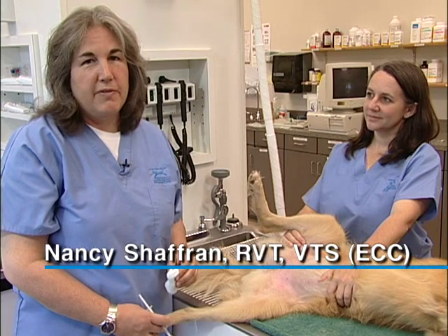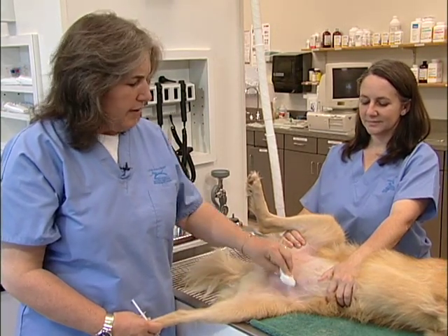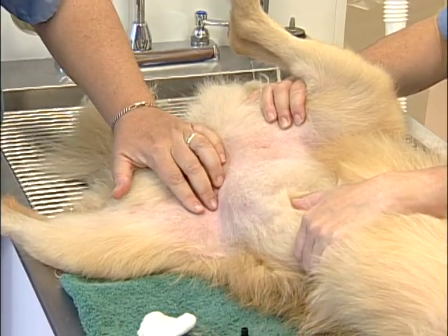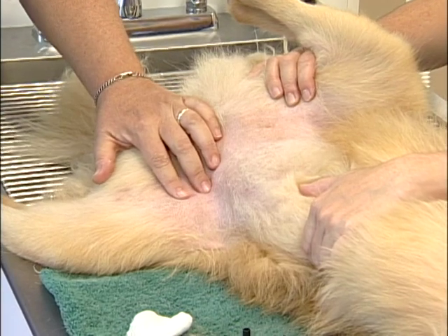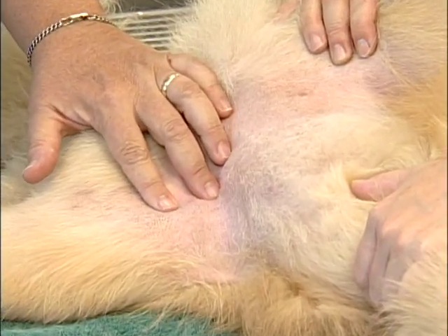I'm going to demonstrate obtaining an arterial blood gas sample from the femoral artery of this dog. First I'm going to clean the area over the artery with a little bit of scrub solution. Then I'll take my fingers and palpate over the area where the artery lies using two fingers, so that I can find the direction of the artery as well.